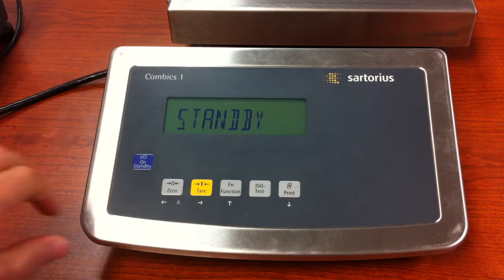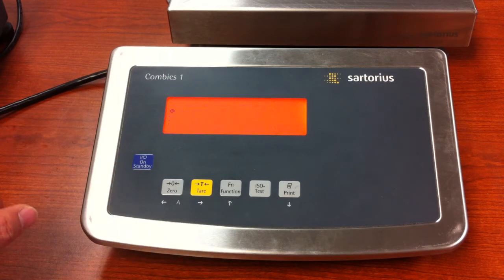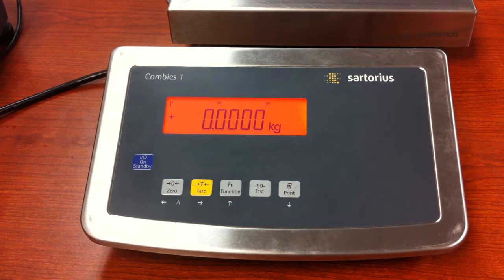The way we calibrate is by first turning the unit on and making sure that we are at zero. If you're not sure, just go ahead and press and release the zero key, just to be certain.